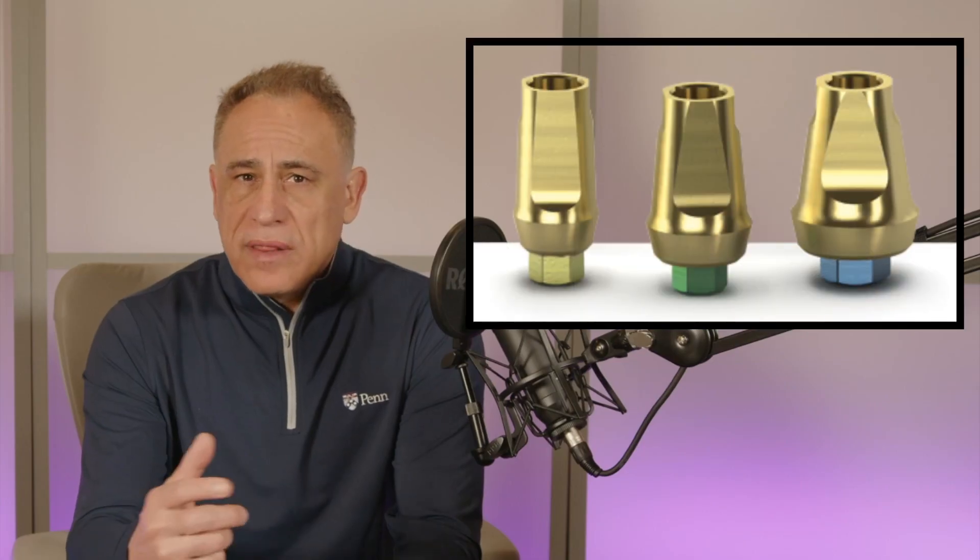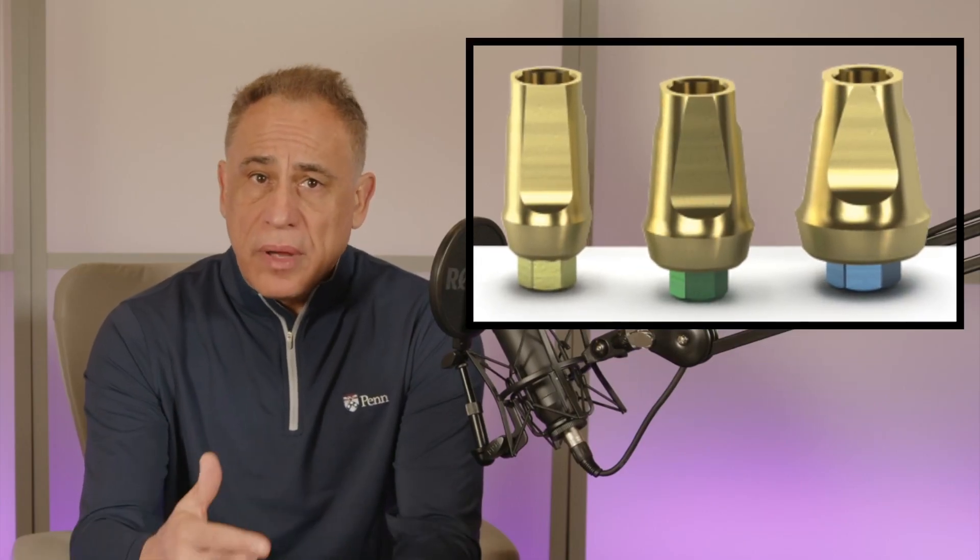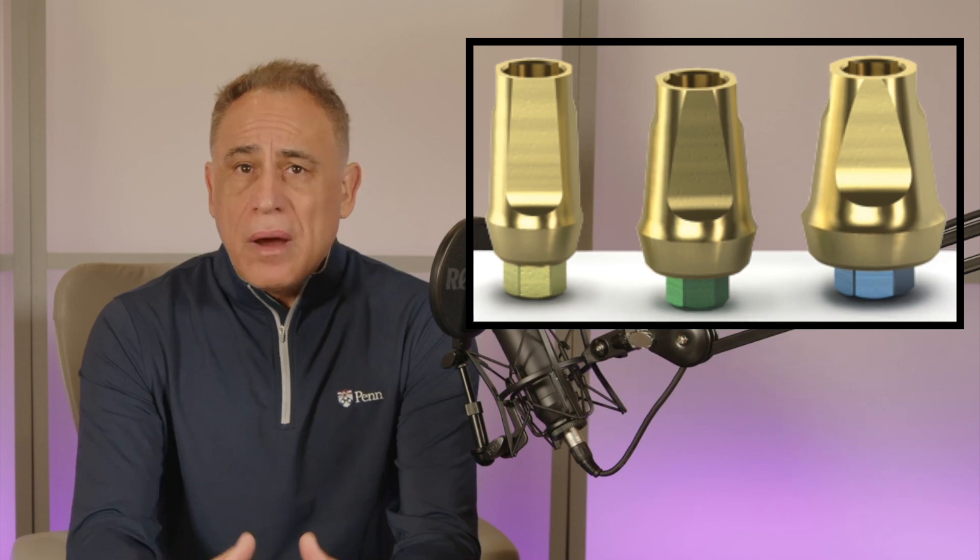While there are stock final abutments available, my recommendation is do not use them. Final abutments should always, always, always be customized — that is, if you want a tooth that looks good, is easy to clean, and also lasts longer.